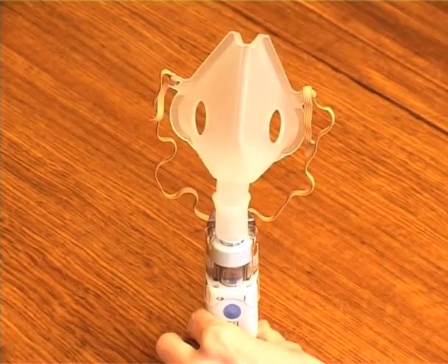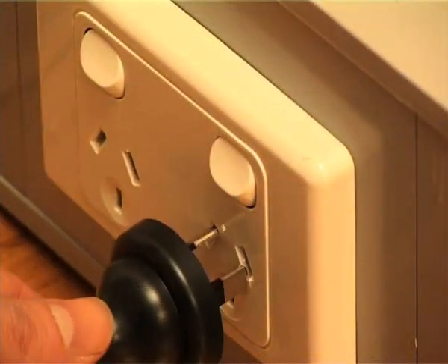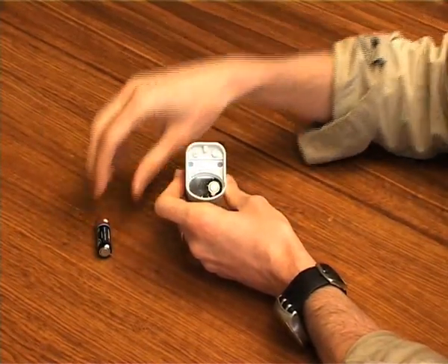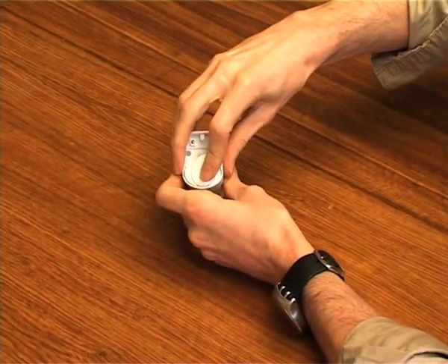Unit Power. Place the main unit on the AC adapter and plug the power cable into an electrical outlet. Alternatively, insert two AA size batteries with the correct polarities into the base of the unit. Omron recommends the use of alkaline batteries.